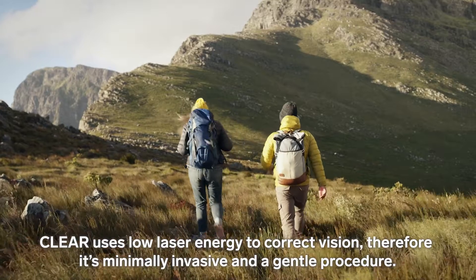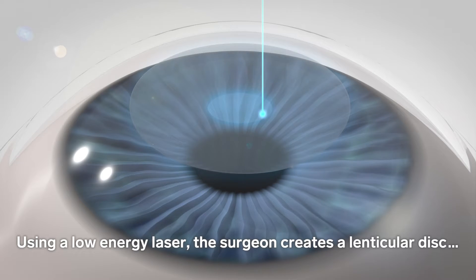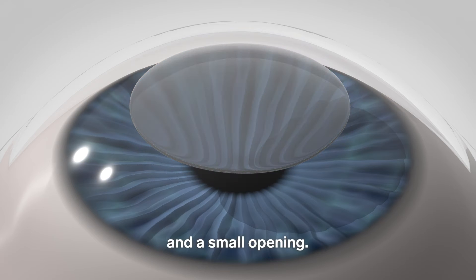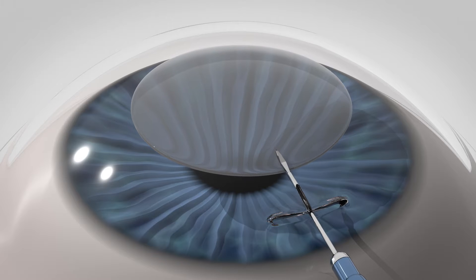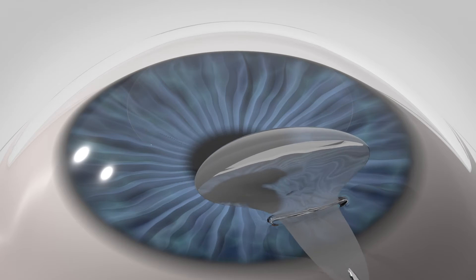What's different with CLEAR? CLEAR uses low laser energy to correct vision, therefore it's minimally invasive and a gentle procedure. Using a low-energy laser, the surgeon creates a lenticular disc and a small opening. The lenticule is removed through the opening with minimal stress to the cornea.